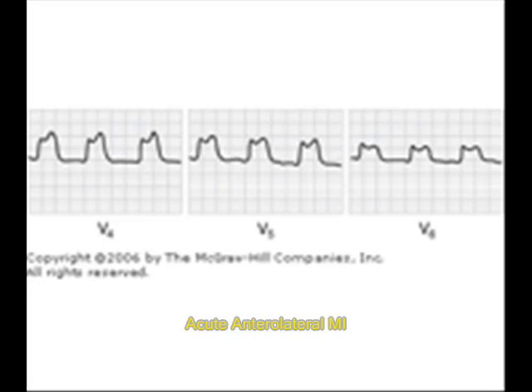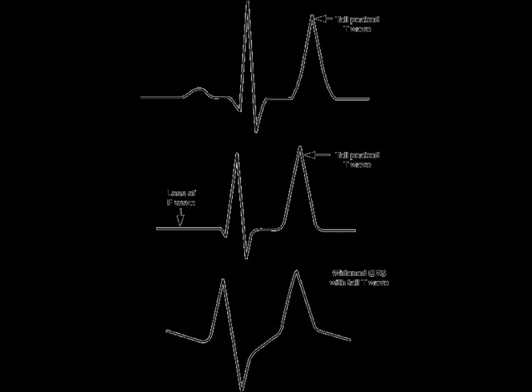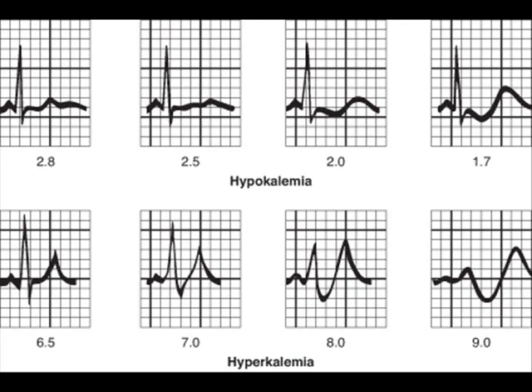Now let us see abnormalities in electrolyte disturbances. First, hyperkalemia. In hyperkalemia, you will see big tent-shaped T waves. You can see clearly here — the T wave is as big as the QRS complex. This is very characteristic of hyperkalemia, that is high potassium level in the blood. When you come to hypokalemia, that is low potassium level in the blood, you can see U waves. The QRS complex is followed by T wave, then that is followed by U wave. U wave is simply the wave that follows T wave.